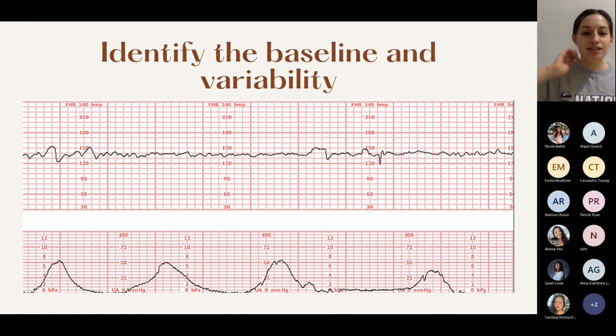So it's really important to pay attention to your little boxes. If you're not quite sure, because at first glance you could be like, oh, this is minimal, but it is going to be your moderate still. You guys have any questions on that before we move on?